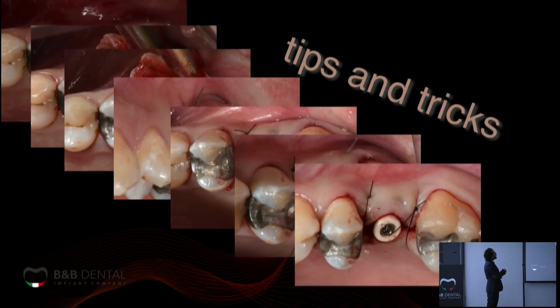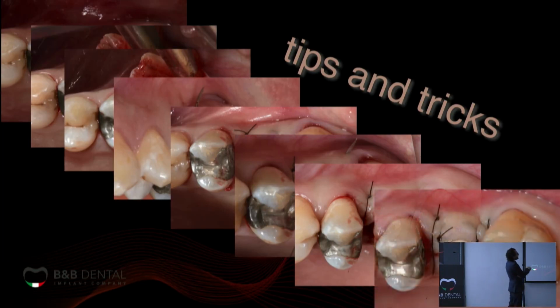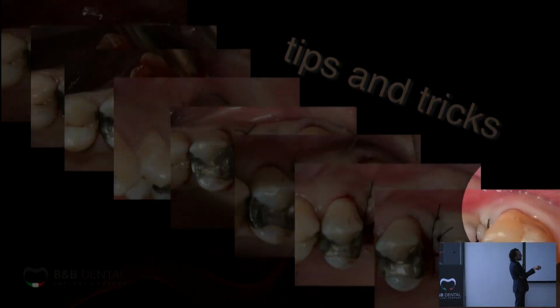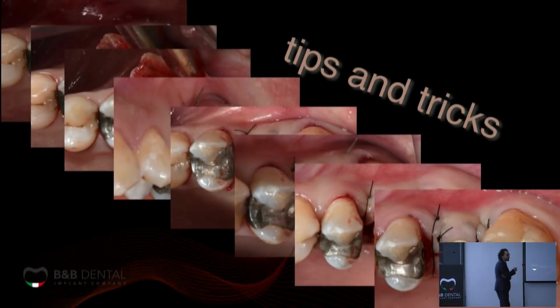And this is the aspect when you just knot the two sutures. And just after the surgery, without any CTG and without any big reconstruction, we change the aspect of the implant.